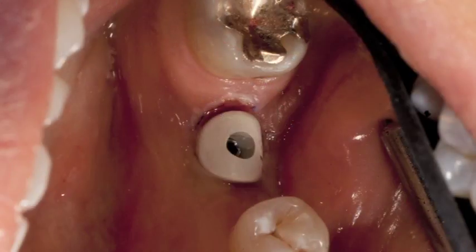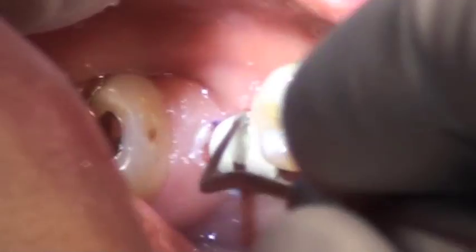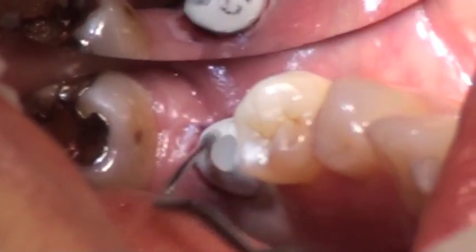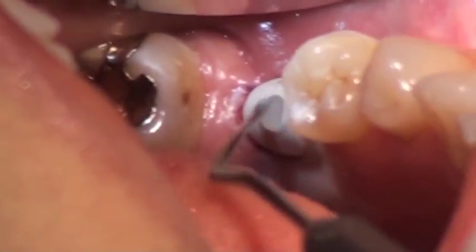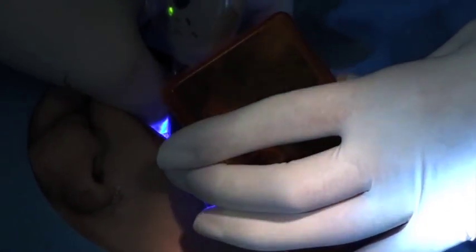What you ideally want to do is seal that screw access opening so it doesn't create a food trap or leak into the implant. You want to cover the head of the screw — in this case with a cotton pellet — though you could also use Teflon tape or gutta percha as other options. Then you seal the opening with either a resin or acrylic; in this case Dr. Psyche used a light-cured resin cement.